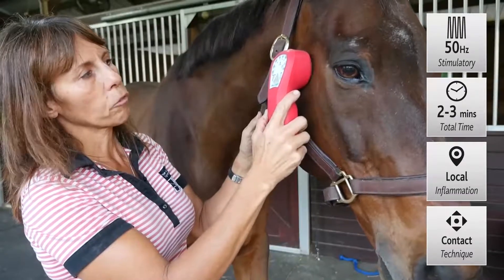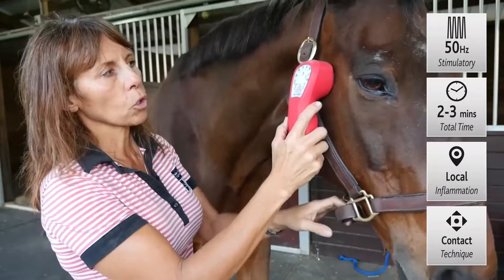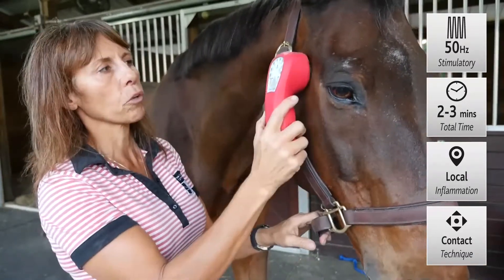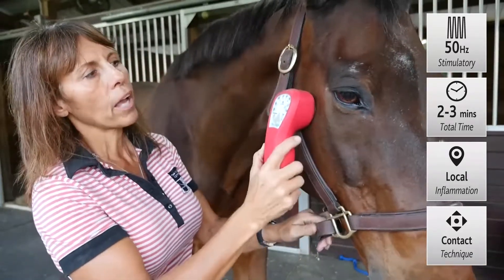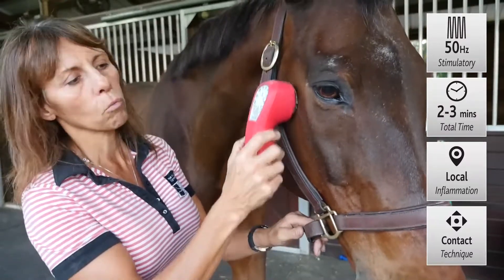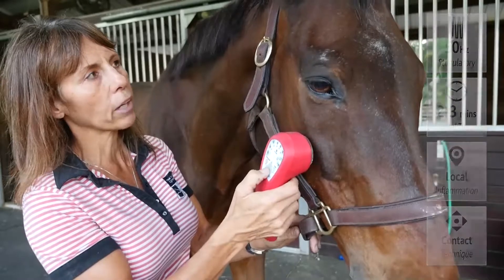You can just stay on the one area if you feel like it's just the facial nerve or whichever nerve. You'd get your anatomy book out and figure out where your nerve roots are exiting the foramen in the head, and then treat those specific areas along that way. That's one treatment you could do for that area.